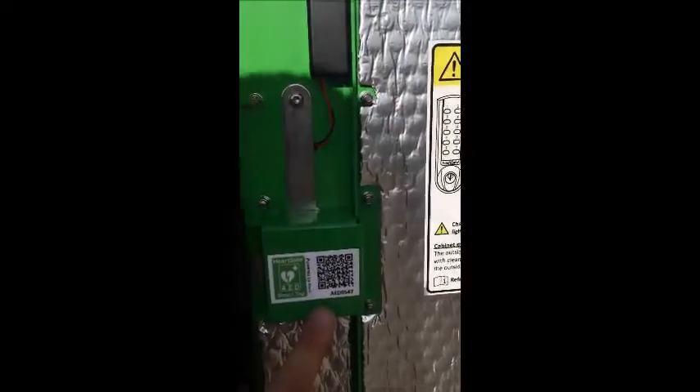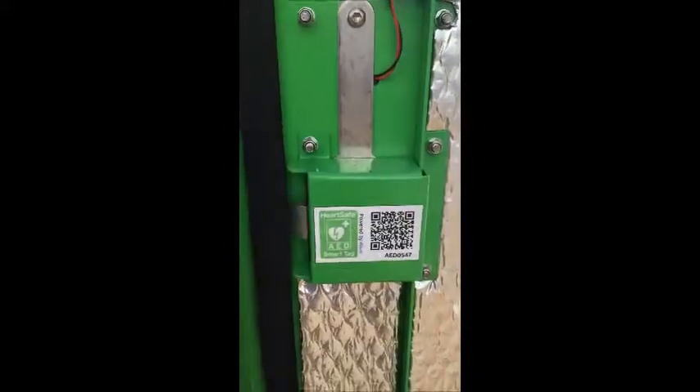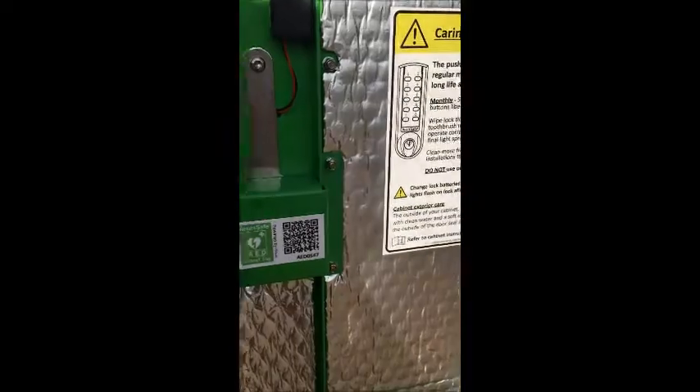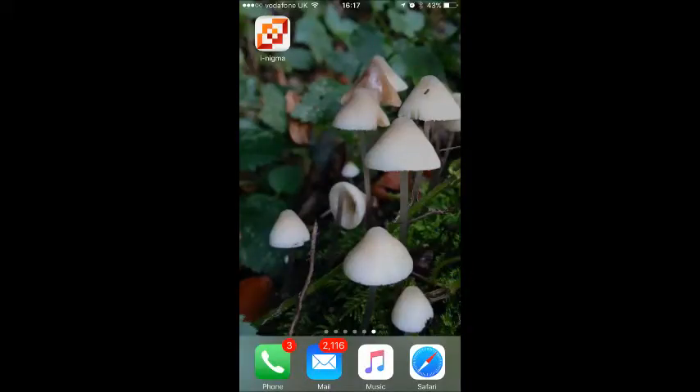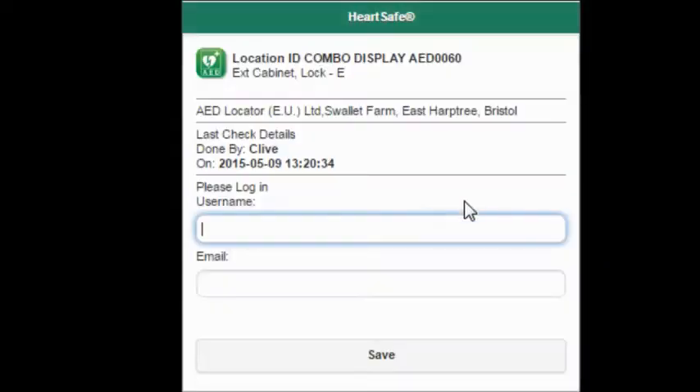What we're going to be doing is looking for the smart tag. This is the tag in the cabinet that allows you to complete your check. The app that we use is called Inigma, a free QR code reader that you can download from the app store. Open this app and use it to scan the tag inside the cabinet.